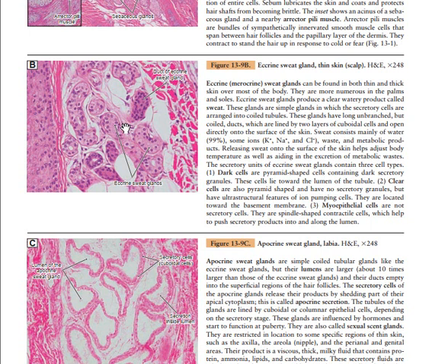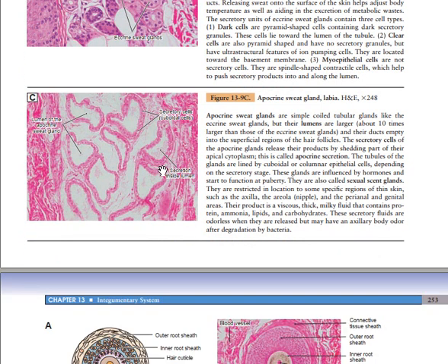Lastly, the other cell type inside the eccrine sweat gland is the myoepithelial cells, which are not secretory cells, but spindle shaped cells which have contractile function. So they contract and push the content of the sweat gland outside.